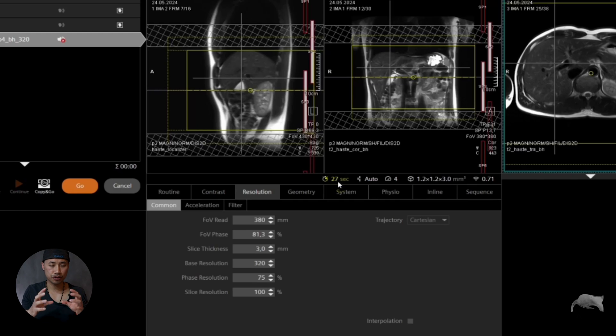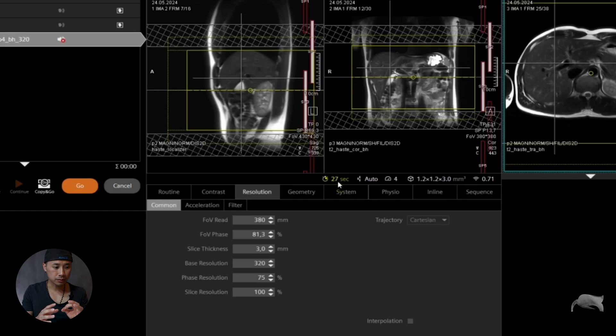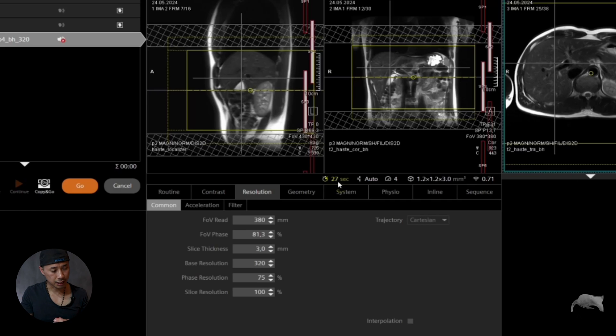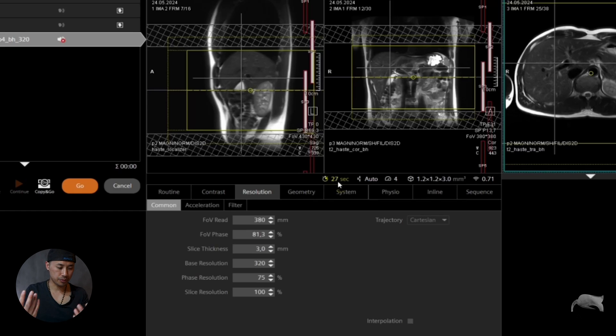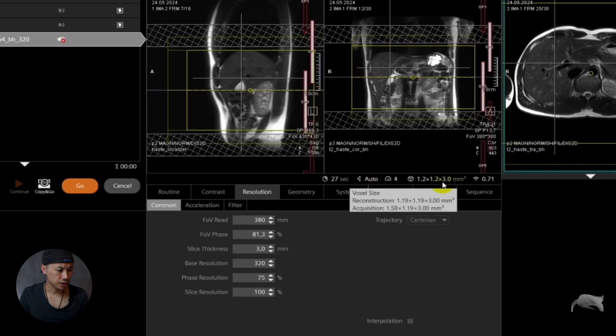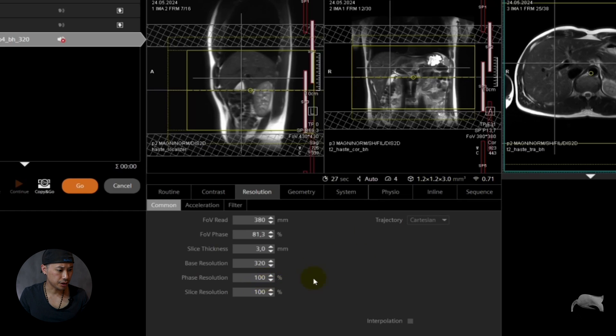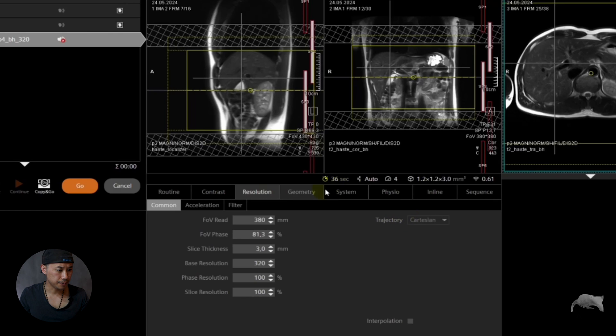And you lose SNR of course. You lose SNR because the resolution now is better with the voxels smaller. So everything is better but you lose SNR and the scan time goes up. Very difficult for the patient to do a breath hold for 27 seconds. So if you choose the phase resolution 100% here as well, let's hover over here.